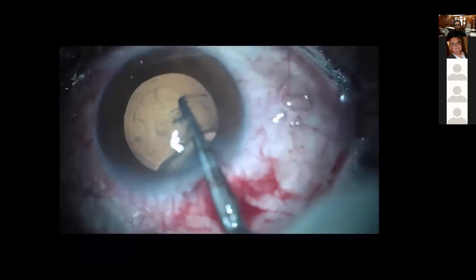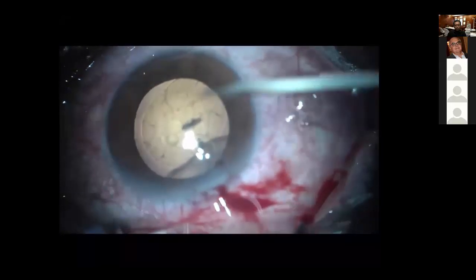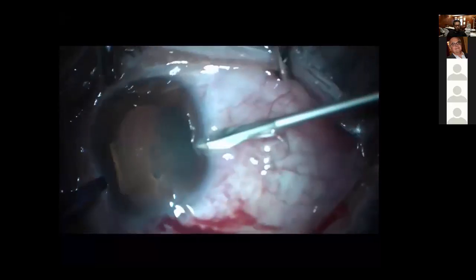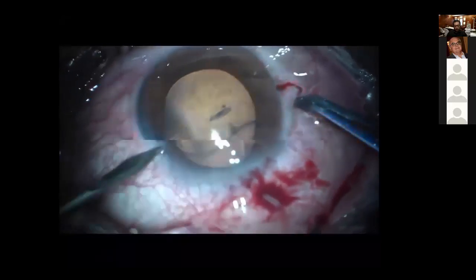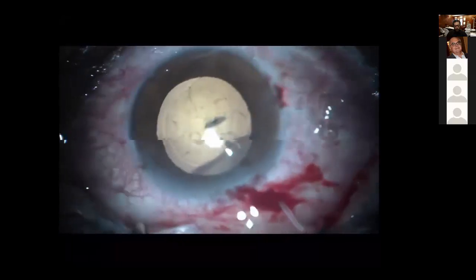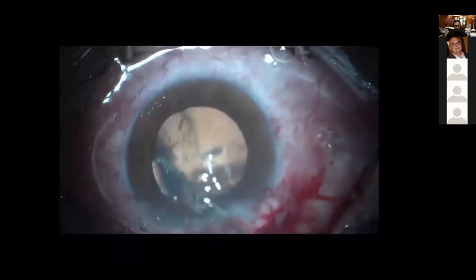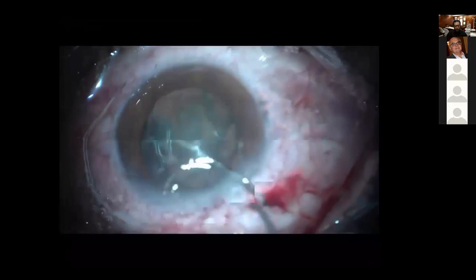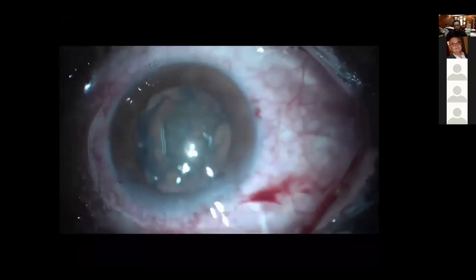If the lens was clear, which was not such a case, I now resort to specially manufactured lenses to be placed as ICLs or IPCLs, which I find quite convenient, because performing surgeries in such cases still carries some risk. As we all know, the risk of expulsive hemorrhage in such cases, once you do some decompression, is very high. So it might look quite easy, but usually it's not, because you might encounter some drastic problems. And are you doing it under local anesthesia or general anesthesia? Yes, local anesthesia.